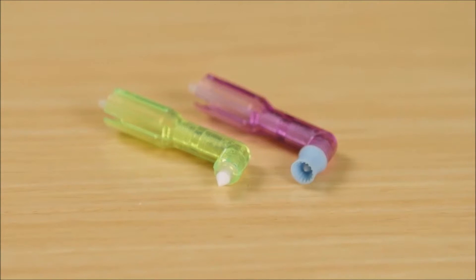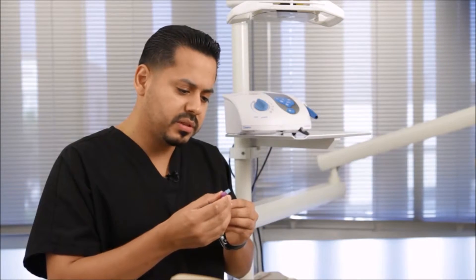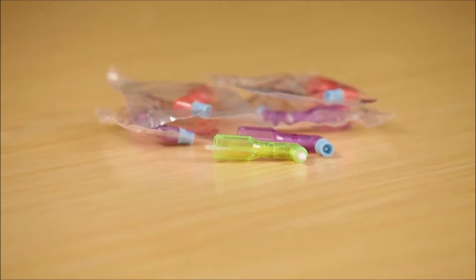Another fabulous feature is the circumference of the cup. It almost fits perfectly around the facial surface of the premolars — it just encompasses the entire surface, which reduces the amount of strokes I have to provide and speeds up the polishing process.